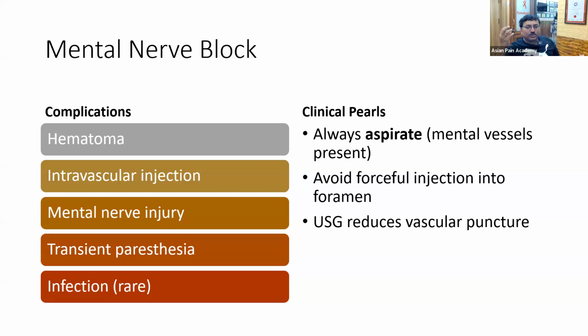if you have some problems near the foramen ovale or close to the Gasserian ganglion, for example a big aberrant artery. In one of my cases, I found an aberrant vertebral artery enclosing close to the foramen ovale. So it was impossible to go close to the foramen ovale. Fortunately, the patient had pain in the maxillary division, so what we could do was a specific maxillary nerve block. So these are the techniques that sometimes need to be employed and changed on a case-to-case basis, based on the patient's condition and the best patient interest. So that we have to do every time.